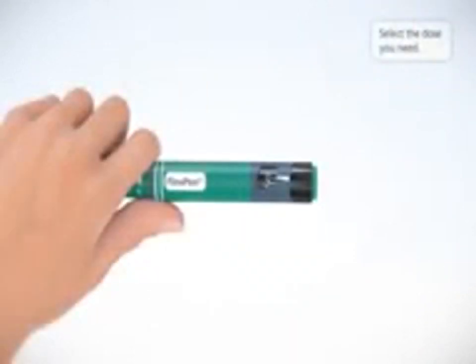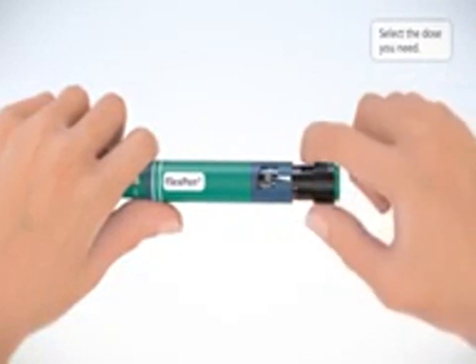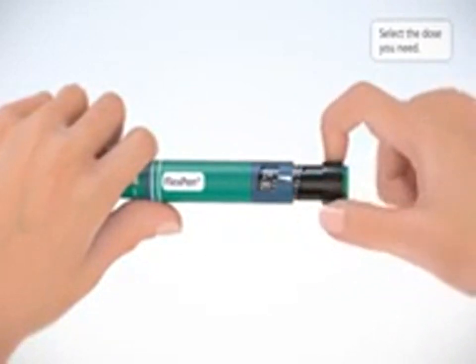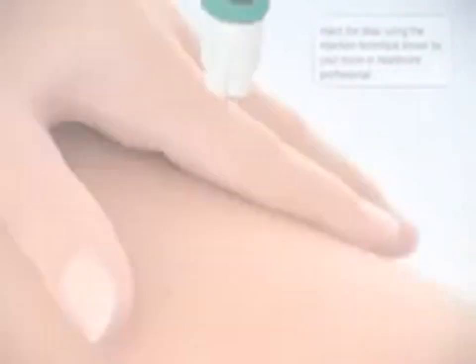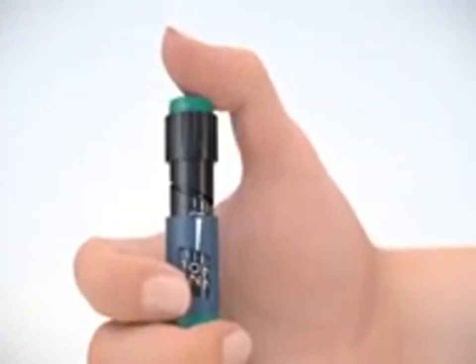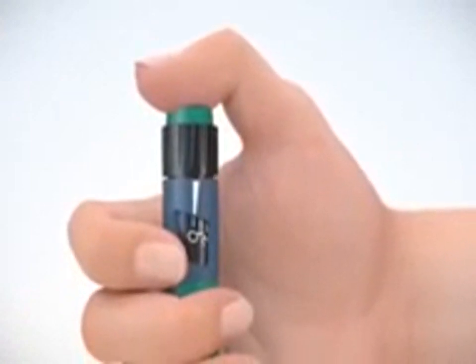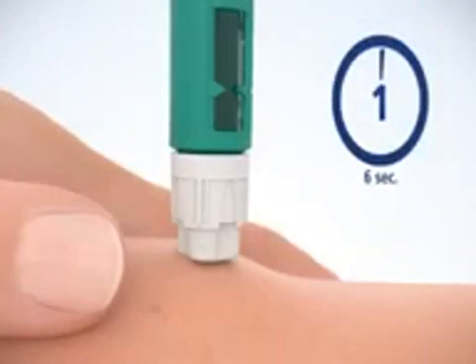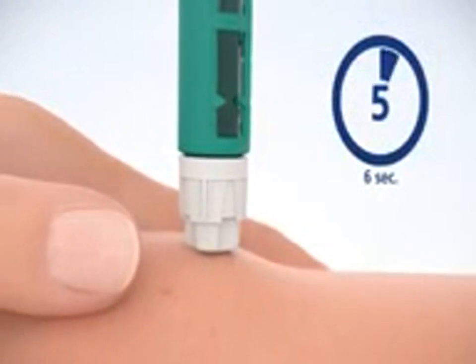Make sure that the dose selector is set at 0 and select the number of units you need to inject. Adjust the dose by dialing up or down if necessary. Insert the needle into your skin and press the push button all the way in to inject your dose. After injection, leave the needle in the skin for at least 6 seconds.